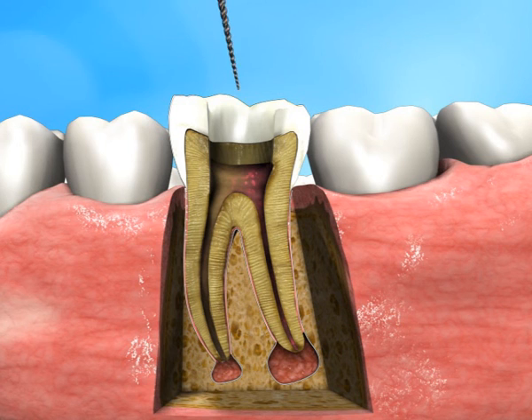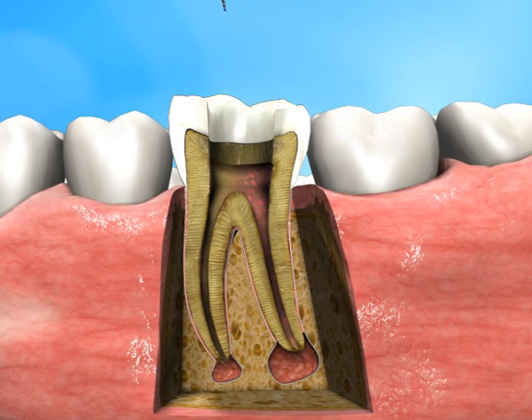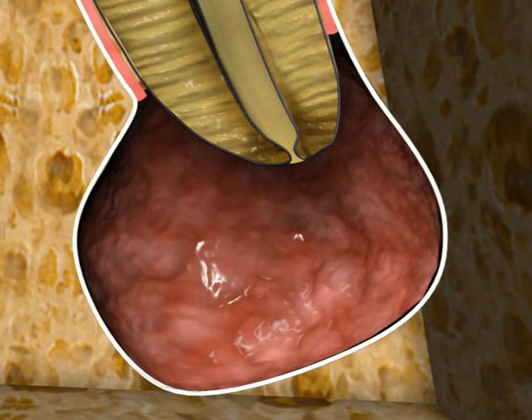During the standard procedure for root canal treatment, an apical patency up to file number 30 is applied, creating a passage through the apex into the periapical lesion. Then an apical stop is made by using a file number 40, positioned at 1 mm coronal to the apex.